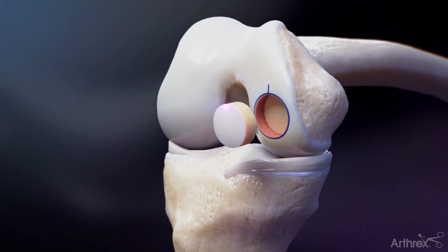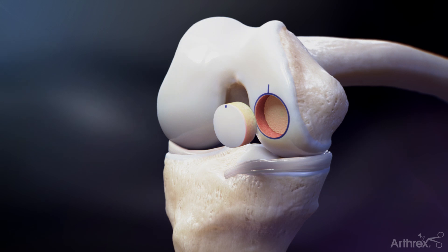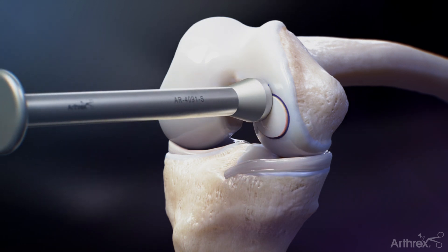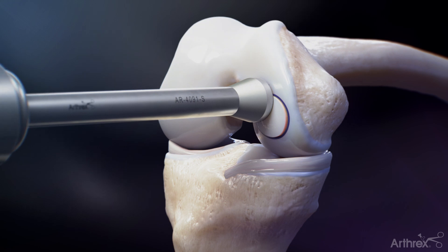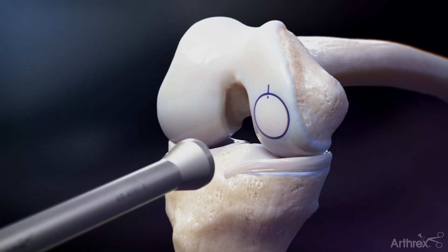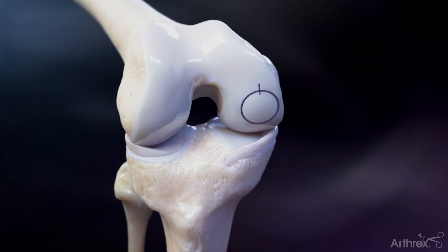Match the graft reference mark with the recipient reference mark for orientation. Advance the graft with firm pressure into the socket. A tamp may be used as needed to achieve complete insertion. Advance the graft until flush with the surrounding cartilage.